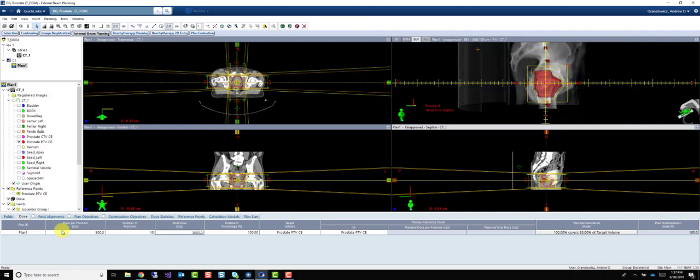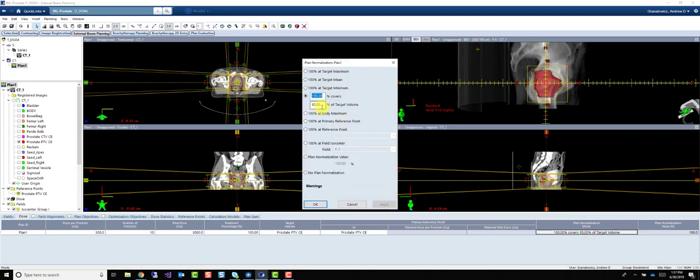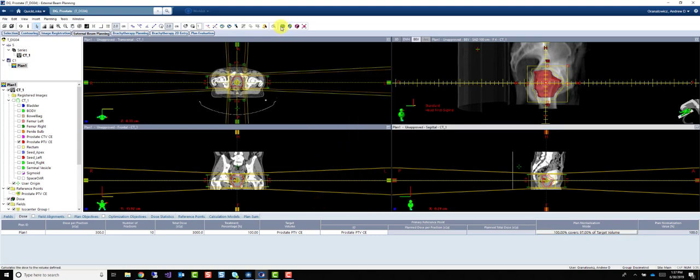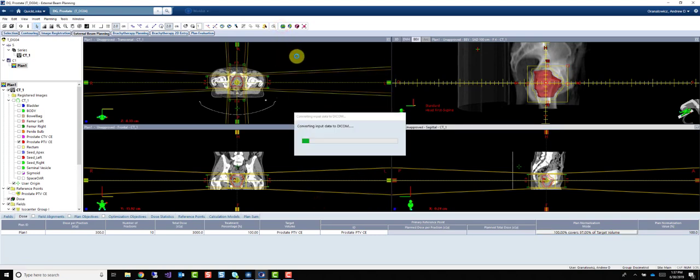We'll do 300 times 10 for this example. And for this case with our four-fields, let's try to do a little bit better than 95% coverage. We'll do 97. And calculate.